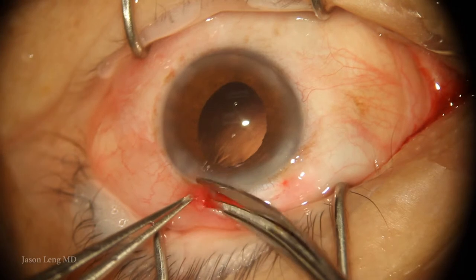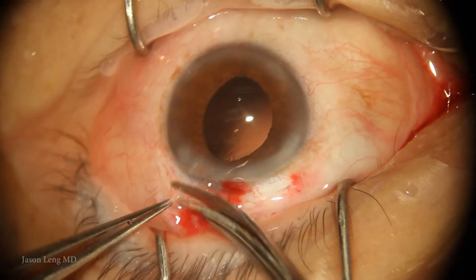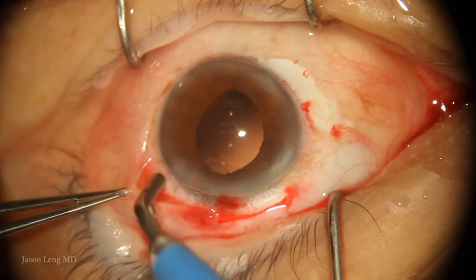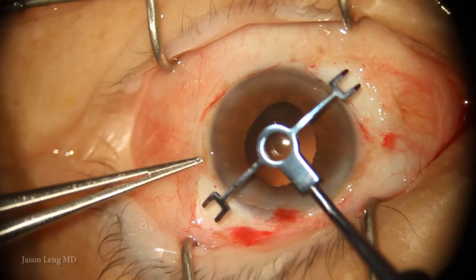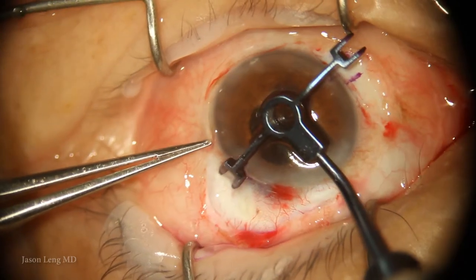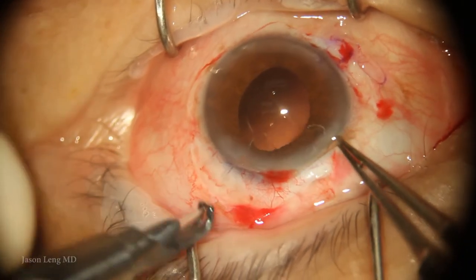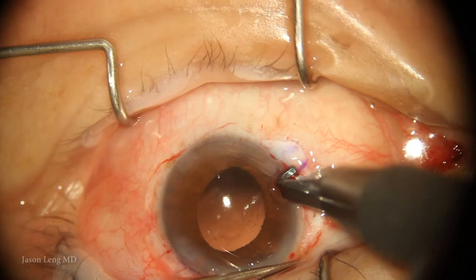I go ahead and prepare for my scleral flaps for the glued IOL. I'm extending my peritomy and creating a new peritomy across in the area where I'll make my flaps. I do a little bit of cautery and get ready for my scleral marks. Using a scleral marker, I center it and try to mark as close to 180 degrees apart as possible. I'm using a guarded AK/LRI knife set at 300 microns to make my partial-thickness flaps.